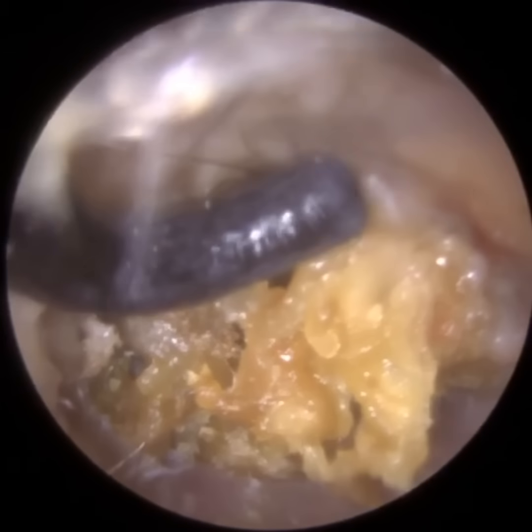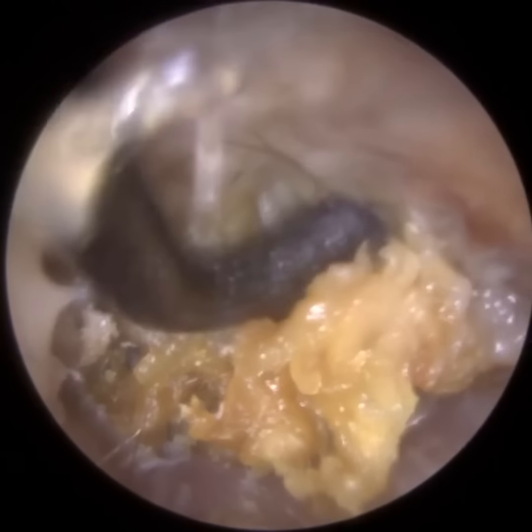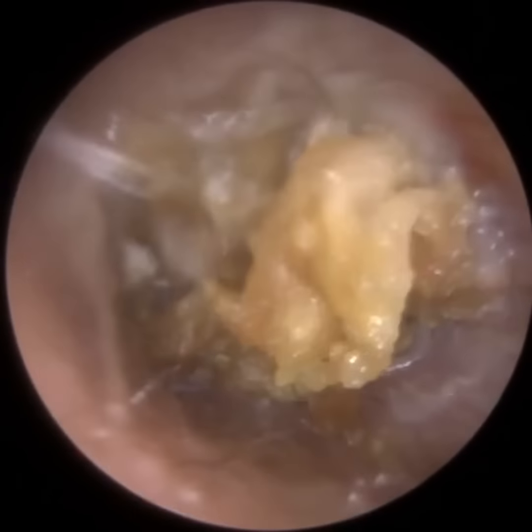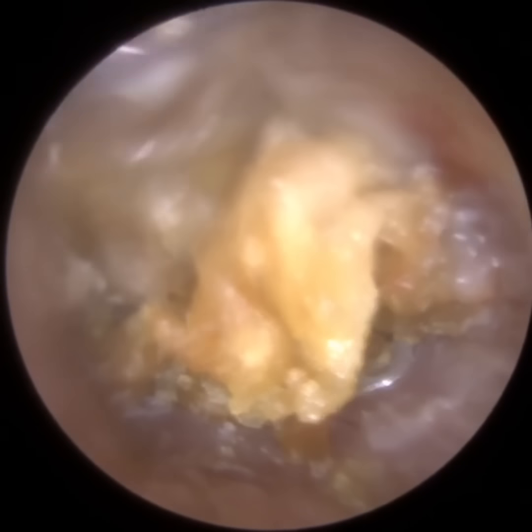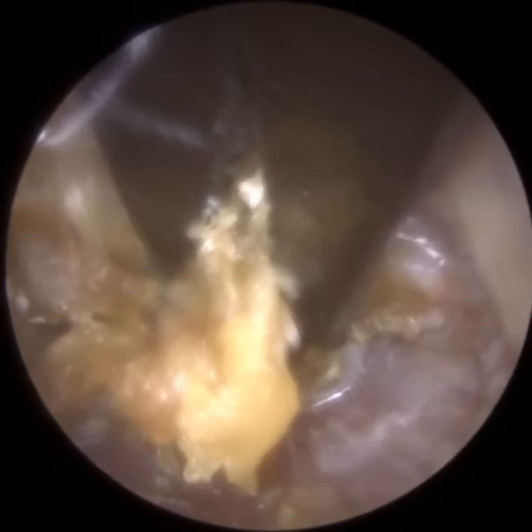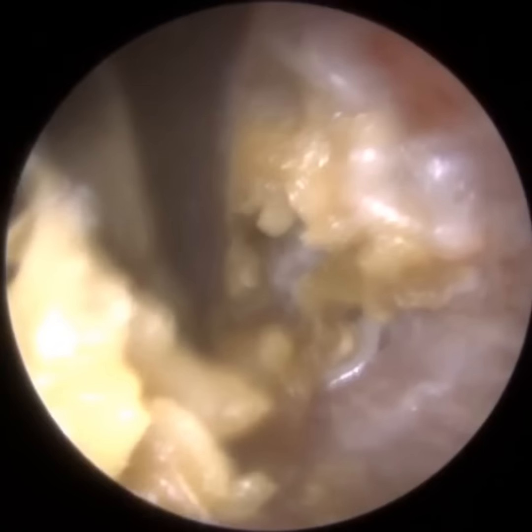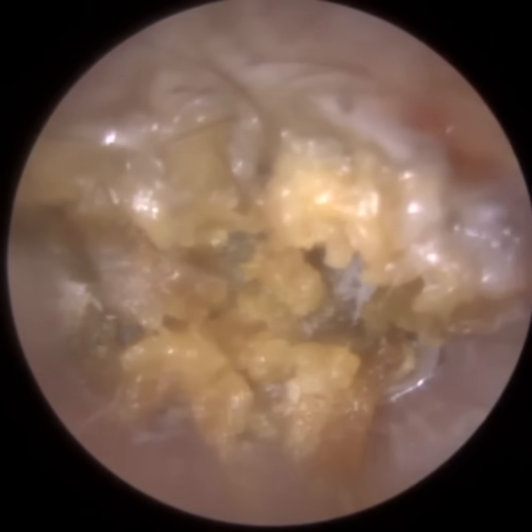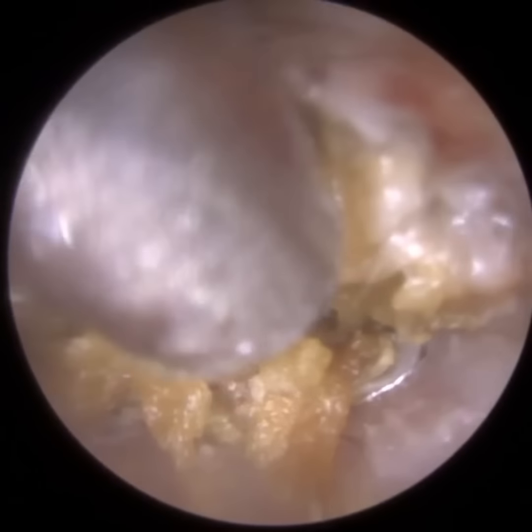And again, I'm just trying to push this skin away from the back part of the ear canal just to loosen it. So I've not attempted to remove it, I've just wanted to break it up a bit, disrupt the surface, back in with forceps. Again, I'd managed to get a sliver of dead keratin skin out, but it didn't start coming out in big lumps. But we're just going to persevere.